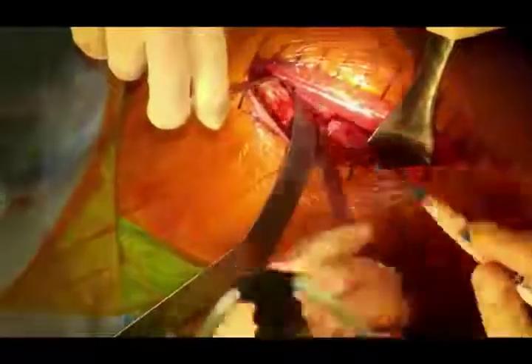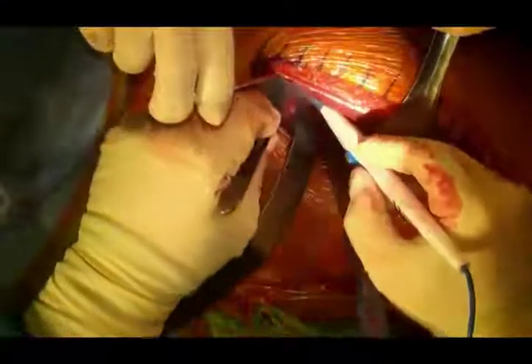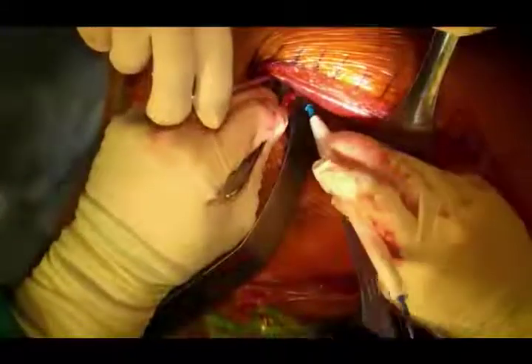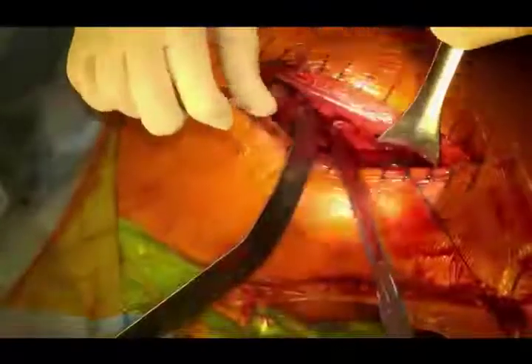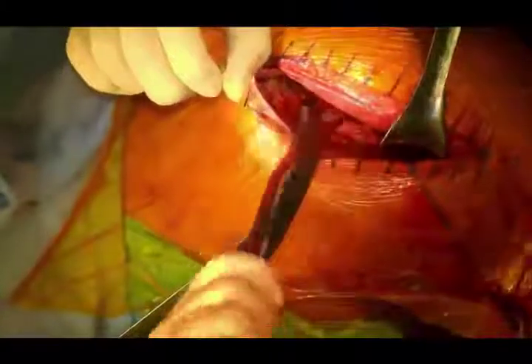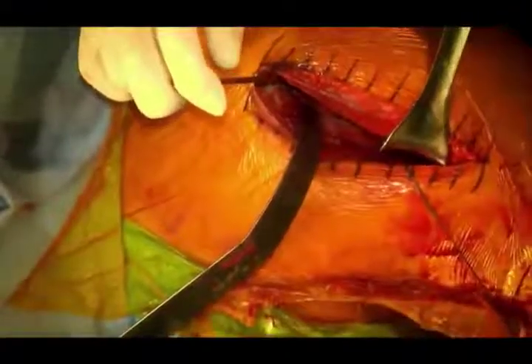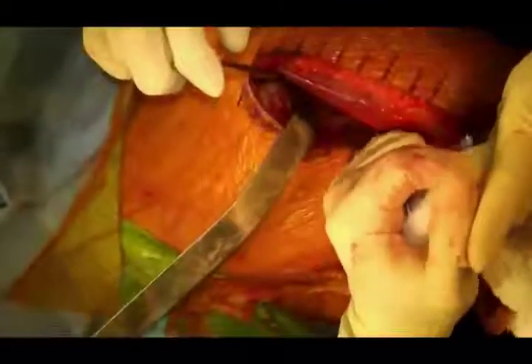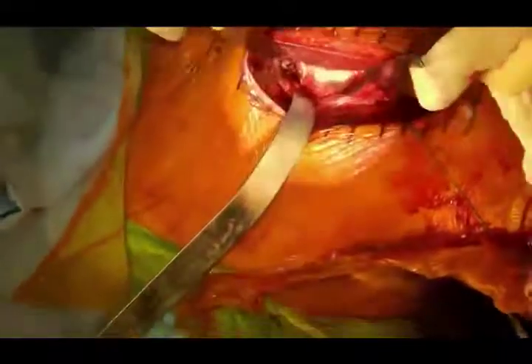I put a homen posteriorly at the 9 o'clock position. I like to do all my anterior releasing first, then go posterior. Let's try the posterior retractor — the smallest one, a very skinny homen. I put this at the posterior inferior quadrant of the glenoid. John Sperling mentioned using a reverse Trendelenburg to sit the patient up more when getting to this part to see the glenoid better.